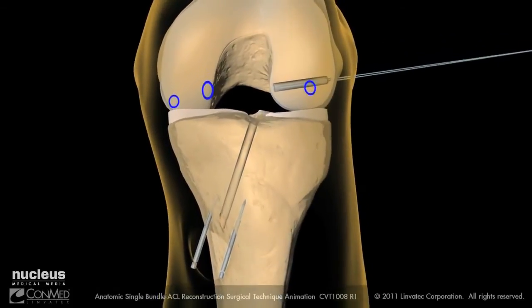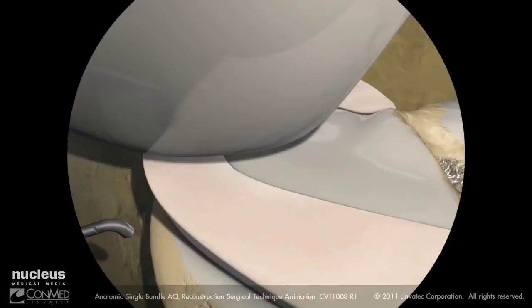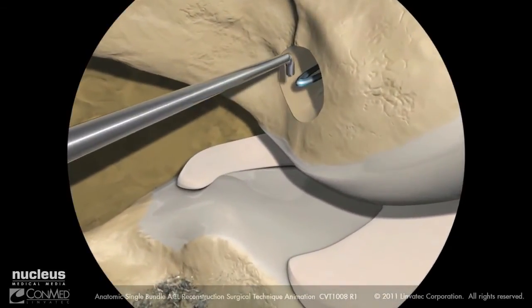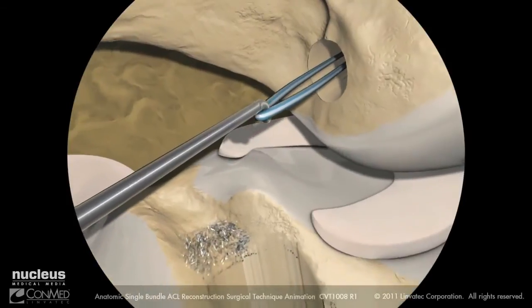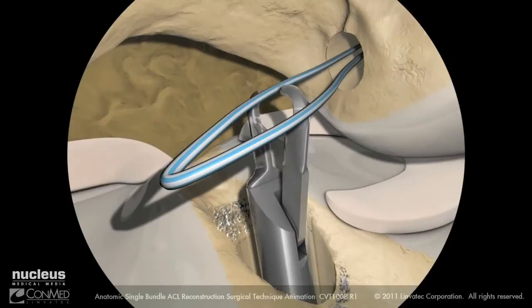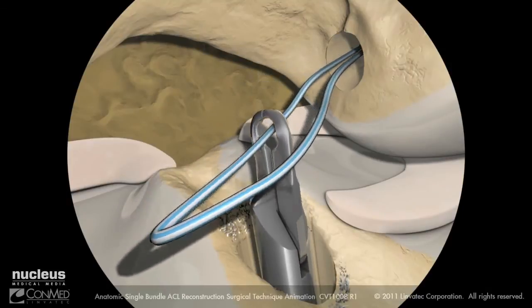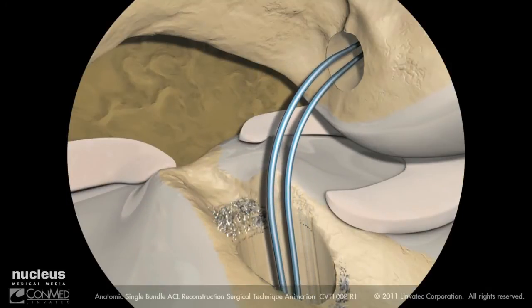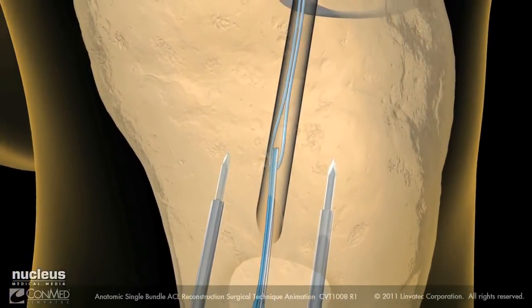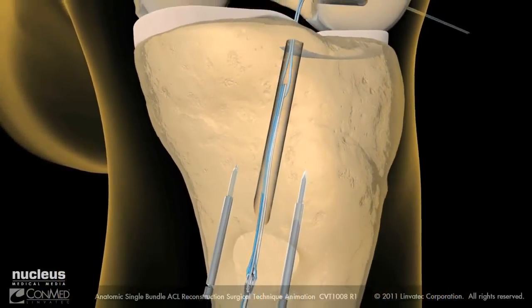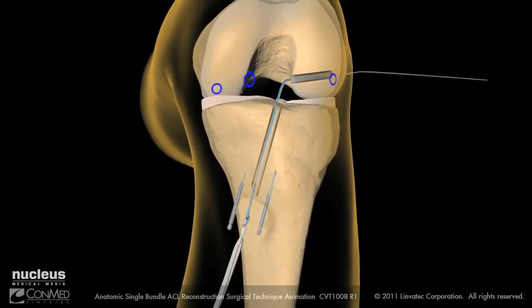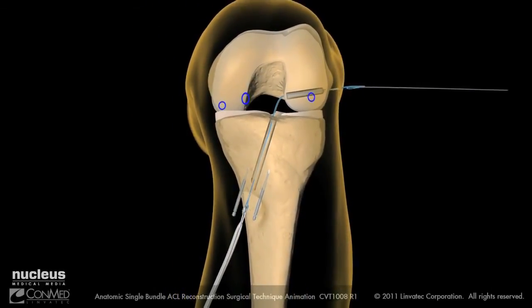Next, place a probe into the accessory anteromedial portal to bring the loop of the suture into the joint. Retrieve the loop through the tibial tunnel using suture retrieval forceps. With the suture loop exposed externally, load the suture strands of the exo-button-loaded graft into the passing suture loop and pull them through the femoral tunnel, making sure to keep the graft construct outside of the tibia.